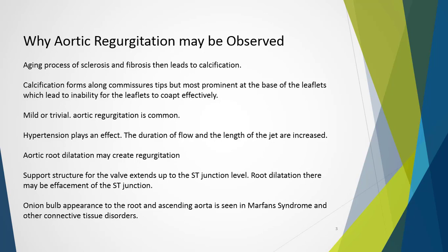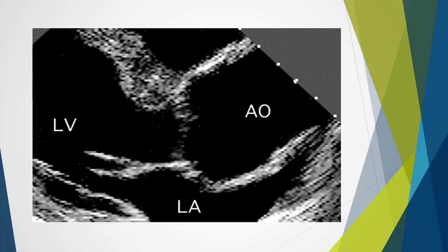The support structure for the aortic valve extends up into the sinotubular (ST) junction level. In some instances of aortic root dilatation, there is an effacement of the ST junction, so the aortic root and the ascending aorta appear as a continuous single tube — aortic regurgitation is highly probable in this instance. A typical onion bulb appearance to the root and ascending aorta is seen in Marfan syndrome and other connective tissue disorders. It's important to note that other valves are often affected, and the mitral valve is more likely to exhibit prolapse. Here we have an example of effacement of the ST junction level, where we see a continual line running up from the leaflet insertion point into the ascending aorta. By pulling the ST junction apart, it weakens the aortic valve and means it's not able to co-apt effectively.